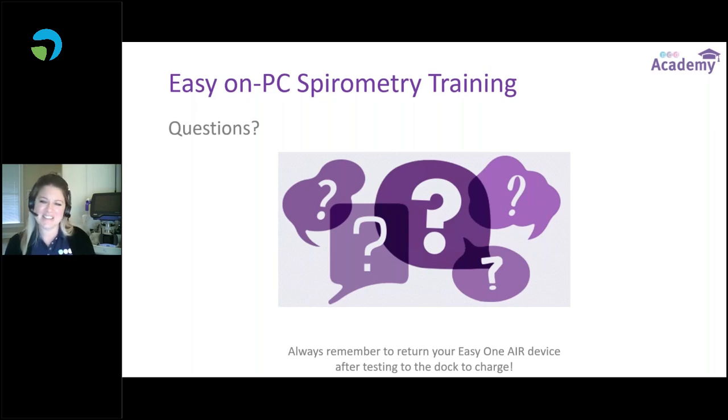The next question is from Savine. What configuration setting do you use to be able to do the inhalation with the mouthpiece already in the mouth? Wouldn't it stop the test immediately when inhaling instead of exhaling? No. On the FVC, because of how this measurement is taken, it's measured when air blasts through that mouthpiece. On our device, you can have the patient take their big deep breath in, then seal, and then blow.